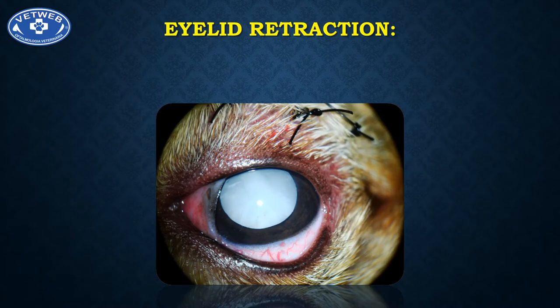Another trick that I do to avoid the use of the blepharostat. Usually I do not use the blepharostat because it causes external pressure on the eyeball, and I don't like that. Sometimes you have a vitreous expansion syndrome that is being caused by the blepharostat. So I do not use blepharostat anymore. Instead, I usually put some stitches holding the eyelid up or down.